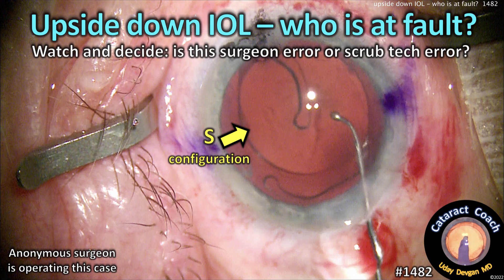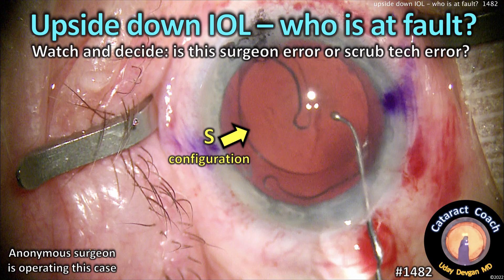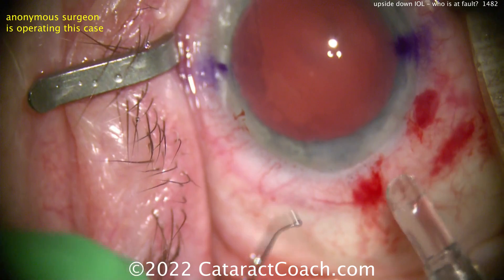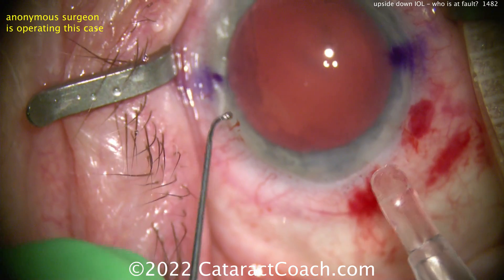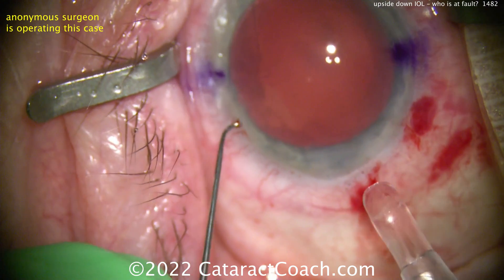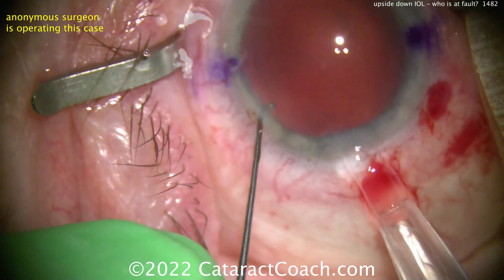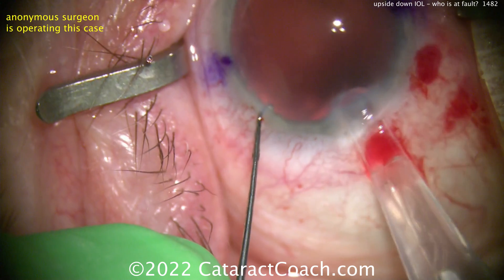CataractCoach.com: upside down IOL — who's at fault? Watch and decide: is this a surgeon error or a scrub tech error? I've got two videos to show you; both were submitted anonymously and I have no idea who the surgeon is.